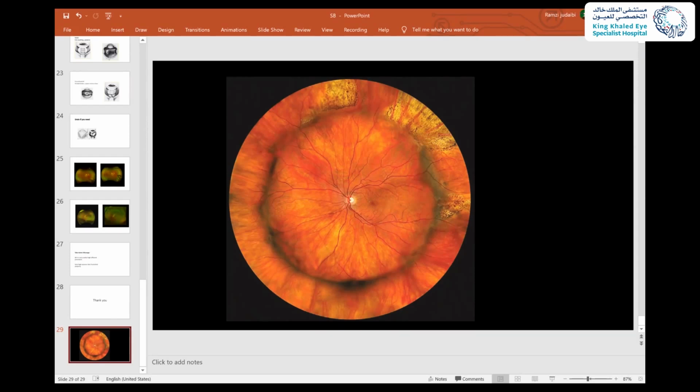It's according to the surgeon's preference. So for me, I prefer chandelier assistant because we are in a training center. So the trainee will see exactly what the primary surgeon is doing at the same time. And this is really a great advantage.